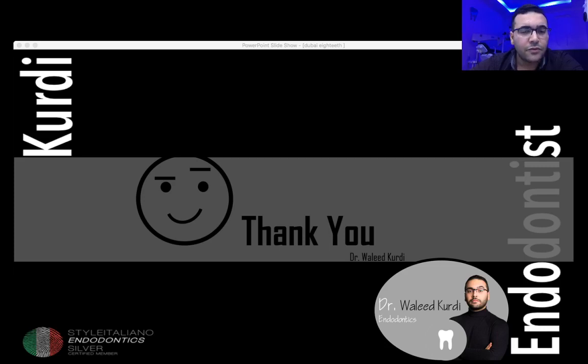Right, guys, if you have any questions, just write them. Can we try to remove a broken file at the middle third if we only have a loupe magnification of 3.5? It will not be easy at all. I'm telling you that it will not be easy at all, because it's not just about magnification. 3.5 magnification is very low, and also the illumination will not be very good. So it will not be easy.